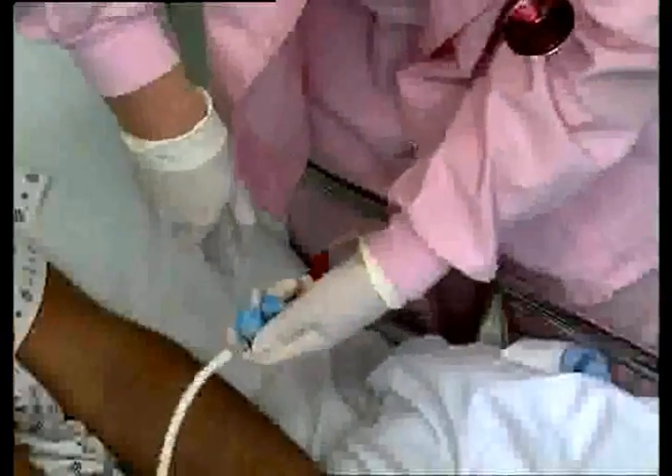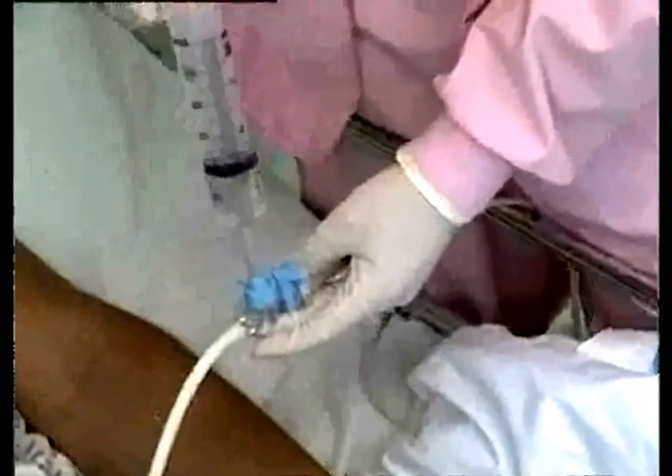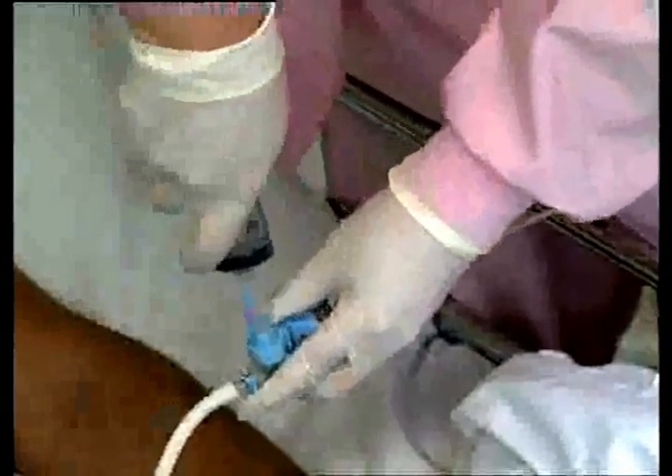The ACE Connector accepts 60-milliliter catheter tip syringes to flush, irrigate, or deliver liquid medications. It opens automatically upon syringe insertion and closes automatically when the syringe is removed.